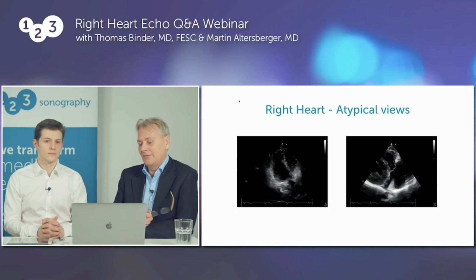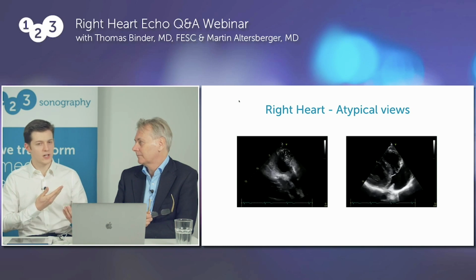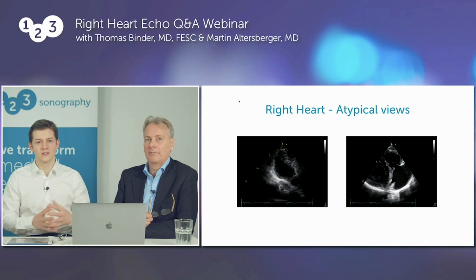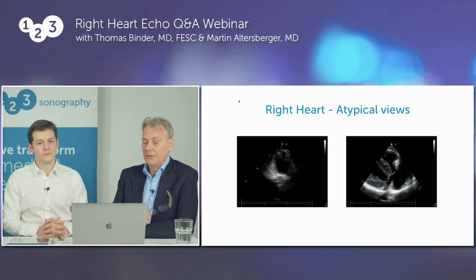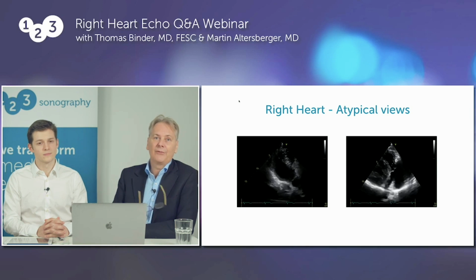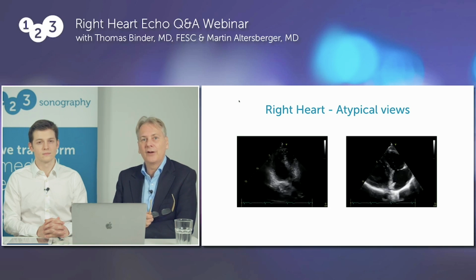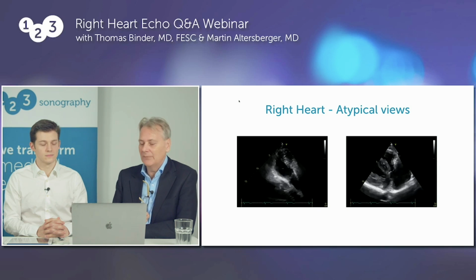So I guess it's very helpful. And it's very useful, especially if you're in a short axis view and you cannot visualize the pulmonic valve. Then very often other views can help you to visualize the structures you have to find in an examination. Right. So use these views. Of course, if you have 3D, you can also perform calculations of 3D volumes and ejection fraction. But if you want to look at the morphology, it's usually better to look at the 2D image.